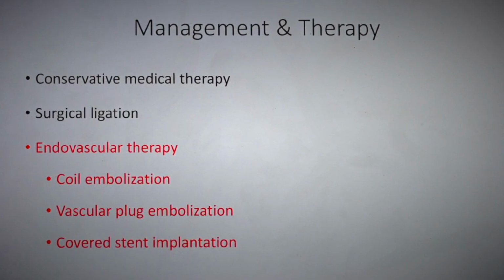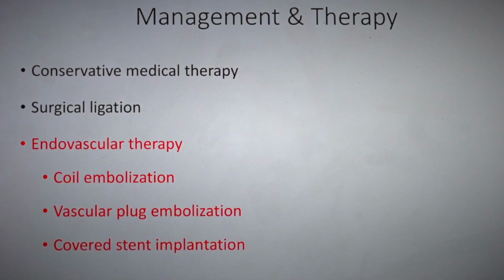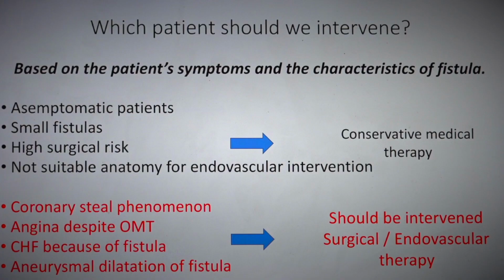Endovascular therapy options can be listed as coil embolization, vascular plug embolization, and covered stent implantation. Which patient should we intervene on is an important question for this clinical entity, and the answer should be based on the patient's symptoms and the characteristics of the fistula.